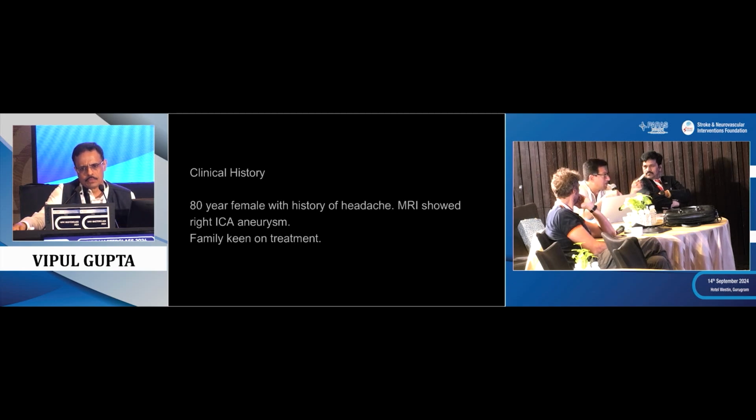But if you see that on your last angio there is still some small nipple there, that means you still don't know at that stage whether she is protected, because there is still some blister there. And that is a problem, because we all have done this. In years of experience we do the same thing, and then suddenly somebody from a family comes, and we change our attitude. We don't do what we normally would have done, and I have got into trouble too. And you think, I wish I had done it differently.